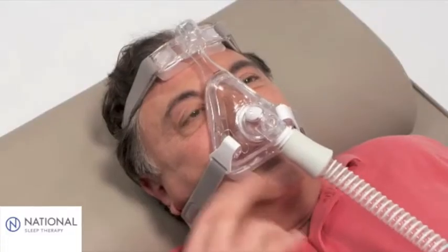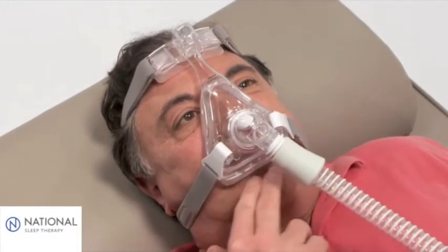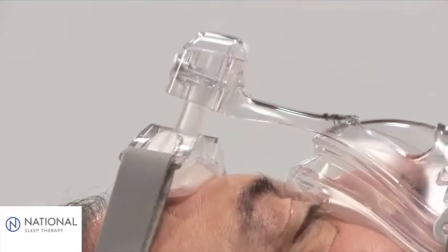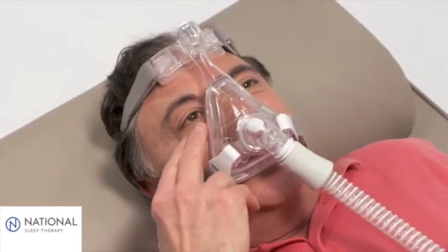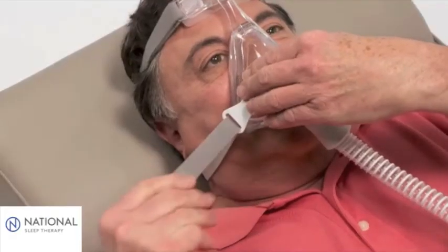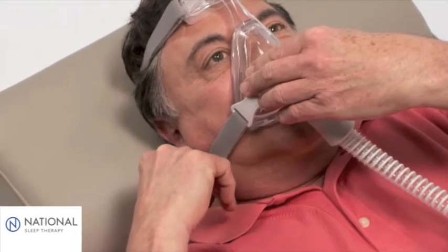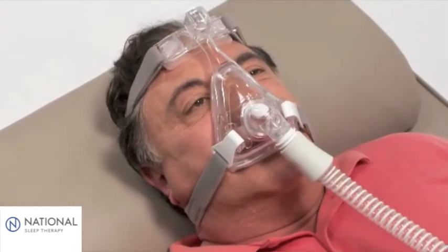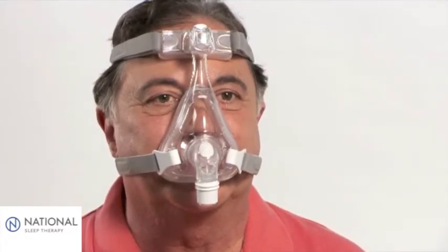To correct leaks around or below the mouth, press and hold the fine glide adjuster to increase pressure in this area. If leaks are still present, apply pressure with your fingers directly to the mask in the location of the leak. If this eliminates the leak, tighten the headgear straps closest to the leak to accommodate the seal. Do not over-tighten the headgear.